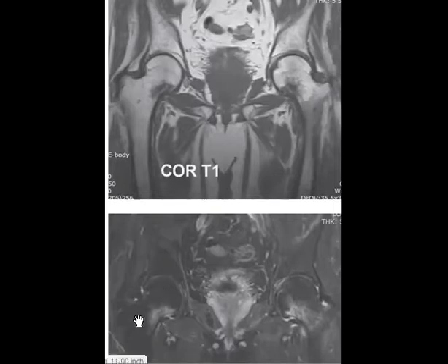The characteristic location, yes. And one of the most common sites will be the femoral neck, okay? History of steroid again. They like the subcapital region, the insufficiency fracture, and the bilaterality. Yeah, the bone density and the site. So if you find osteopenia or osteoporosis in the bone density, then osteomalacia will be one of the top differentials. Okay.